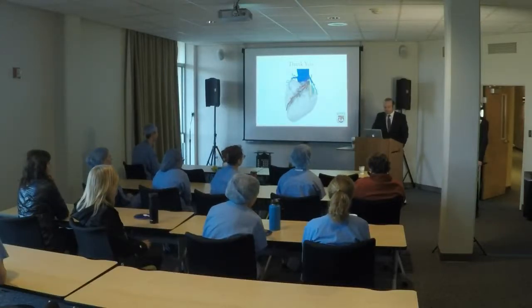Yeah, so I think in the U.S., we're going to see some dramatic changes with guidelines in the next year or two. There's a lot of buzz about CT now as a first-line diagnostic strategy. I think we have really strong data. I mean, the 5-year outcome data from SCOT-HEART showing a reduction in heart outcomes using an imaging strategy, right?